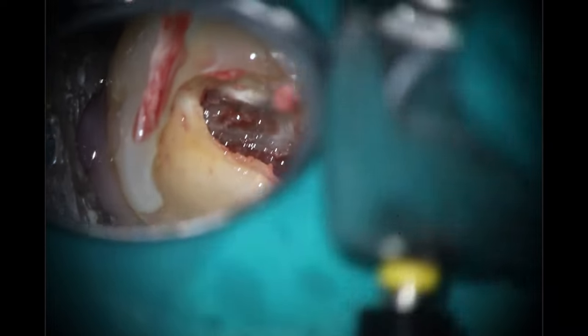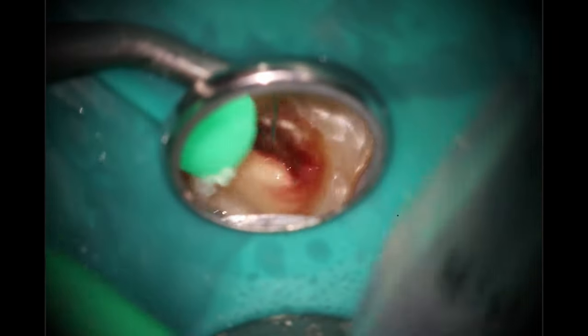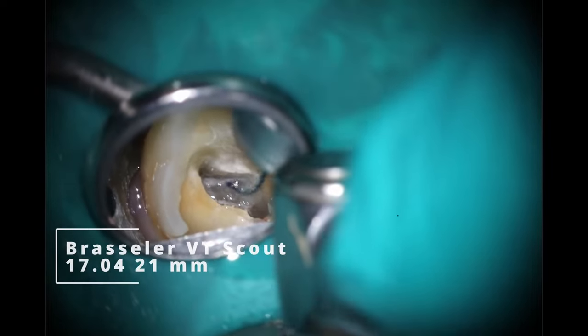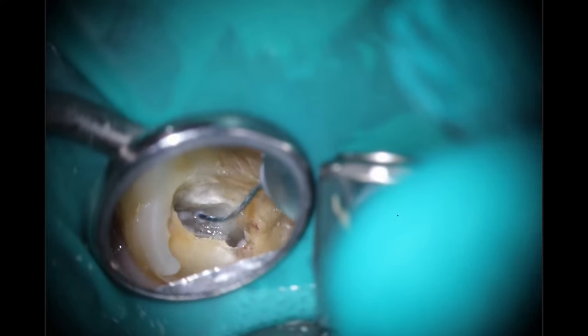This is a really straightforward root canal except for this MB2. At this point I'm fine taking the 2006 down about to the length of where my 8C went — I'm not worried about ledging. We're only going down about four or five millimeters before I hit a stop anyway. This just removes that coronal aspect. We go in here, rinse with Triton like we've talked about, just to get any of that vital tissue out of my way so there's no more bleeding and I can start to work on that MB2. There was a lot more debris in this tooth than I anticipated, especially between the isthmus of the MB1 and MB2. There was a large clap of thunder if you heard that in the background — we've been having weird storms in Reno lately.